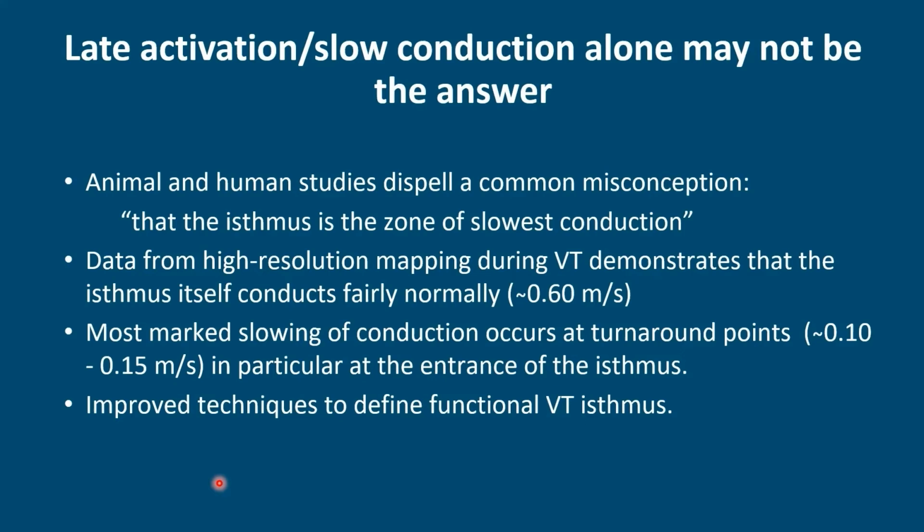And over the years we've actually realized that late potential mapping alone may not successfully identify this. A lot of work has been done on this subject by other colleagues, including Della and Roderick's lab. And in fact, there was the advent of isochronal late activation mapping.